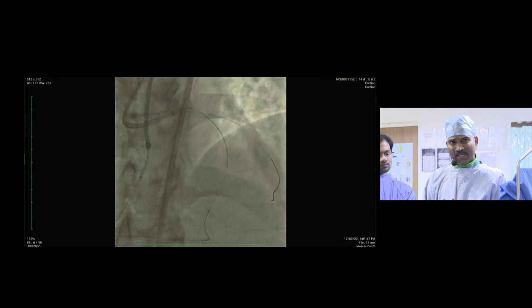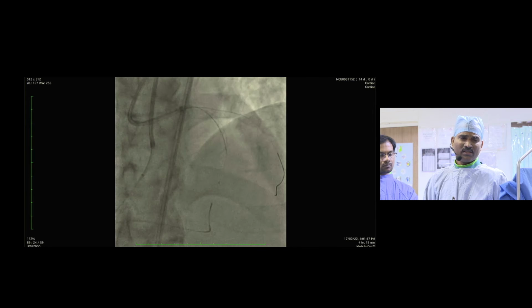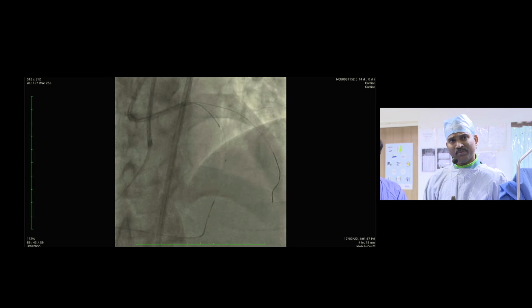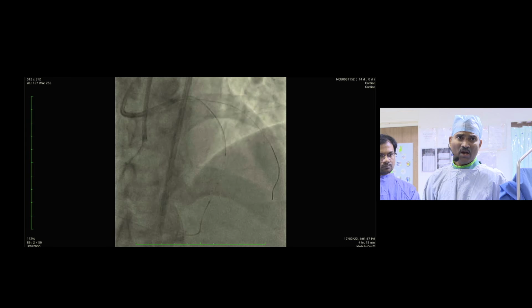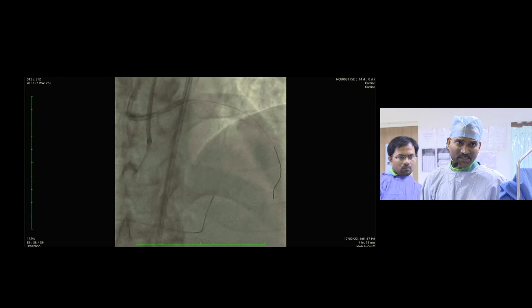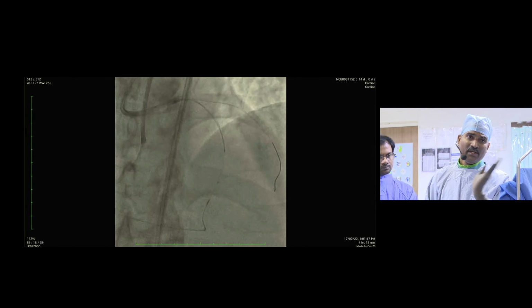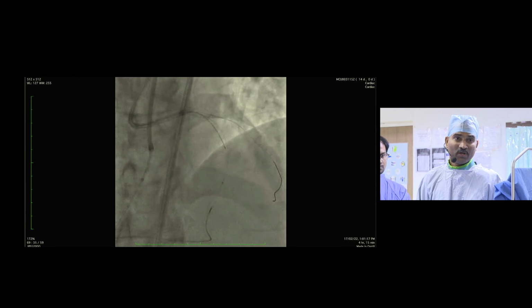So regarding stenting strategy, as this patient had a subintimal hematoma in LMCA, what is paramount is you have to stent from ostial LMCA. My initial plan was only to stent from ostial LAD down, but as I created a subintimal hematoma in LMCA, we decided to go ahead with stenting from ostial LMCA. This is the safest strategy for these patients. So never stent from ostial LAD. If you stent from ostial LAD, you will push the subintimal hematoma further proximal and you occlude LMCA. So that's what we decided.